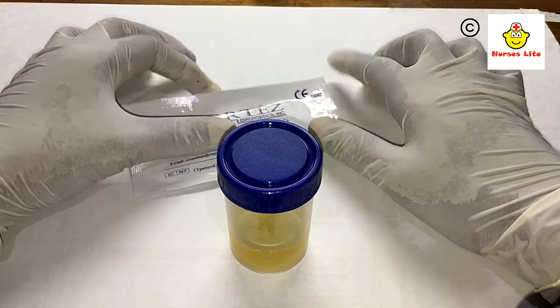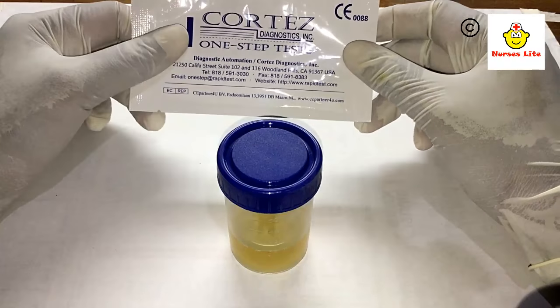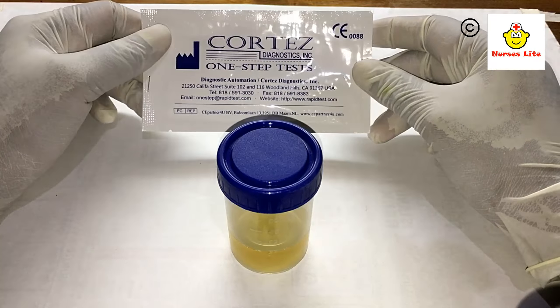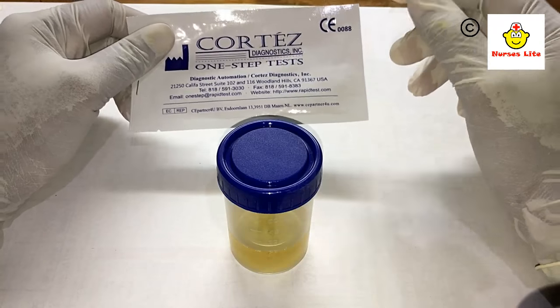Hi friends, this is Nurses Life and welcome to my YouTube channel. Today we are going to perform a very easy test — it is the urine HCG strip test. The important thing about this test is you can do it at home very easily, and it is a very accurate test.